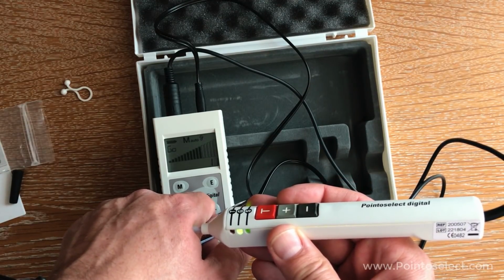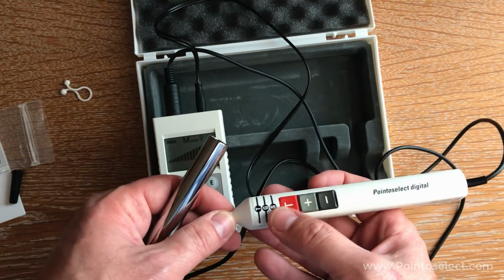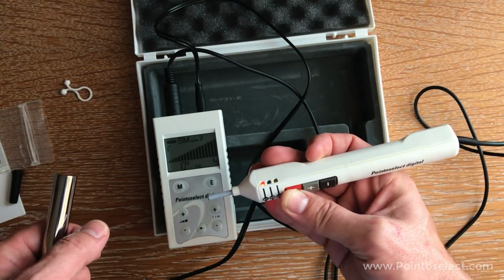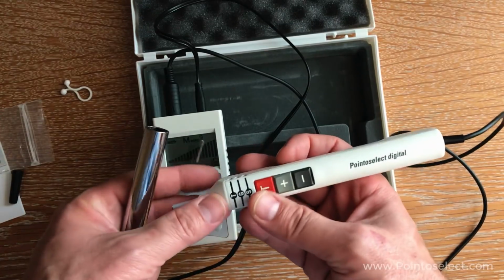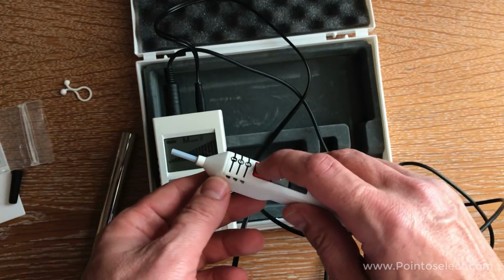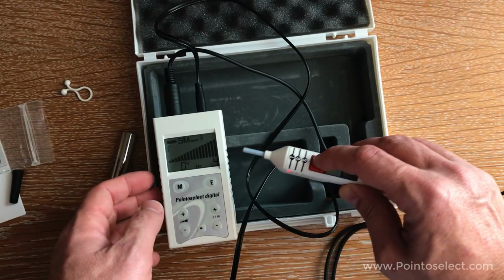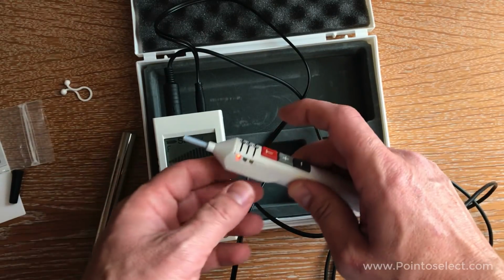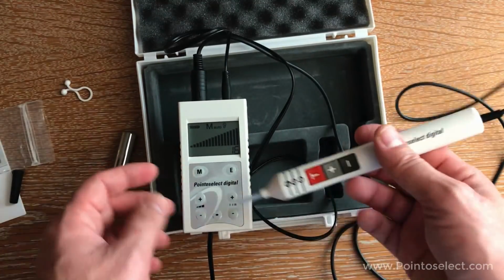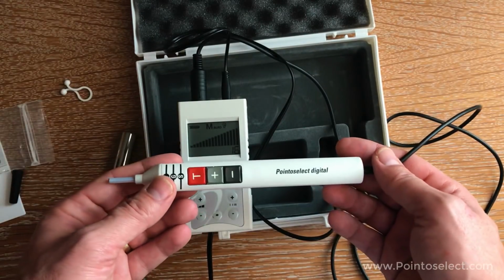So there's silver, there's gold, and other than that, looks the same. If I hit T, I get the treatment light. That light is red, would not be allowed under FDA regulations. In fact, I'm surprised it's allowed at all. Under the new regulations, red lights are only for a danger or warning condition. Interesting. Older design, apparently. All right. Well, so far so good. I can't wait to get back to the lab and do some testing. Let's check it on out.